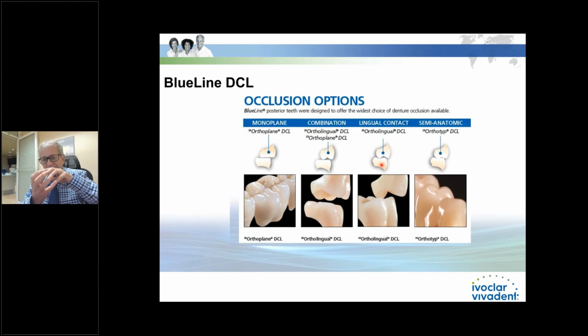They just got that movement, so you don't want to lock them into intercuspading. I want to have freedom. So I would use the 15 degree on the lower, and it will slide and move forward, and it doesn't affect the patient. And then of course I've got the 22 degree that will have to cuspate. So we got everything there.